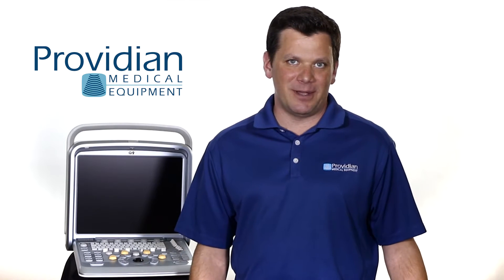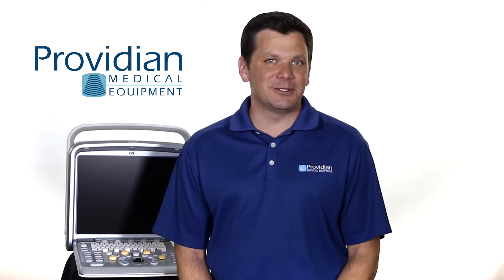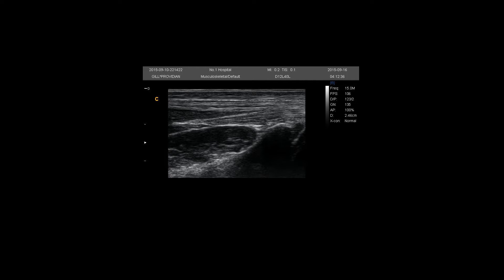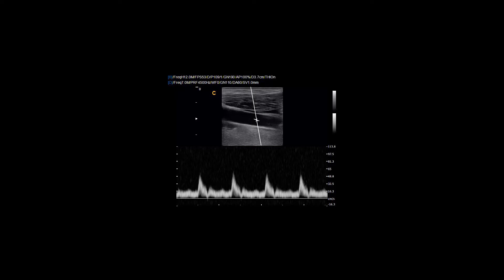Another area where the Chison Q9 really shines is superficial imaging. With an 18MHz probe, it stands out for MSK musculoskeletal imaging and other superficial imaging needs. In my experience and customers' comments, the abdominal imaging was better than the competitors, and image quality is competitive for vascular and small parts imaging.